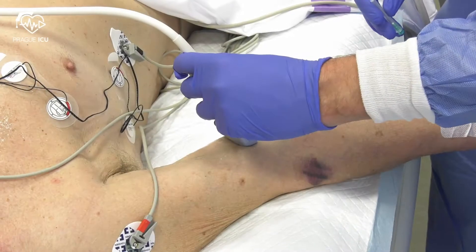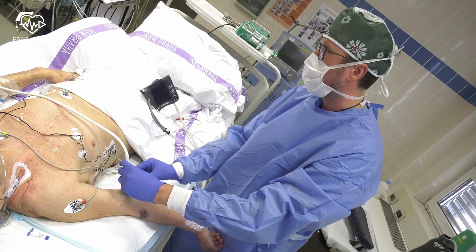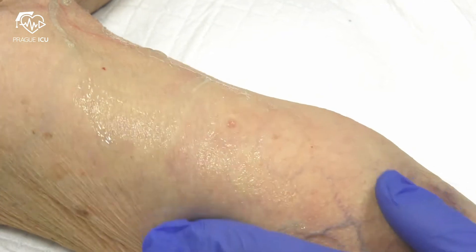Before scrubbing up, perform a provisional ultrasound to check artery diameter and patency. Marking of the puncture site can be done using the needle hub.